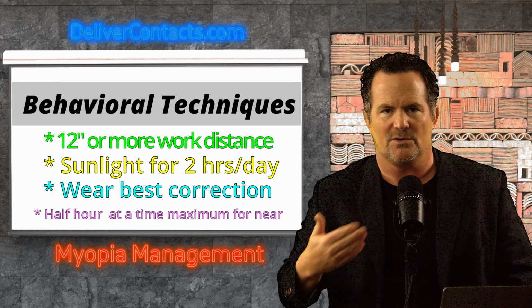So it's great for a new kid who has very healthy eyes anyway. They put a contact lens in, it should fit very comfortably, and they just throw it out at the end of the day and put a new lens in every day. What these MiSight lenses have is a center area to get light focused on the fovea, then a ring of peripheral defocus, then a ring of clear, and then a ring of defocus.